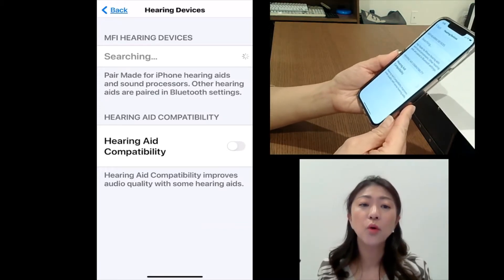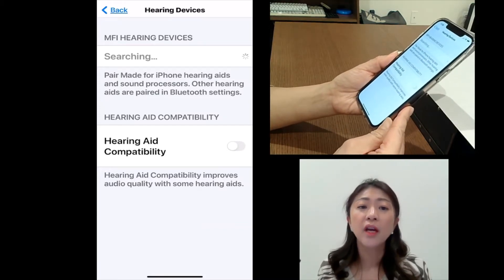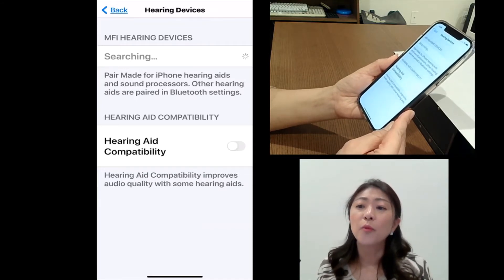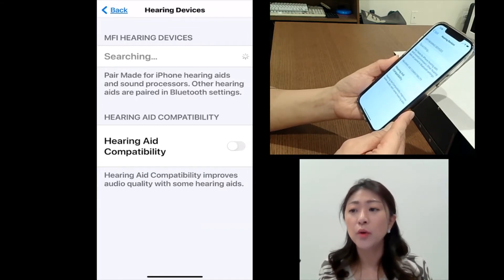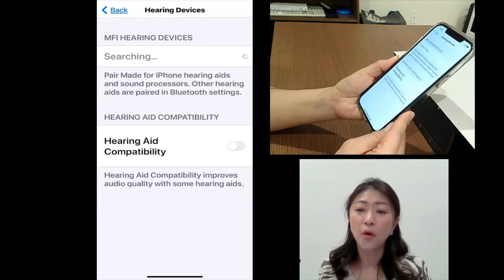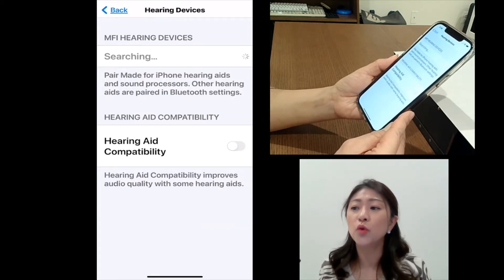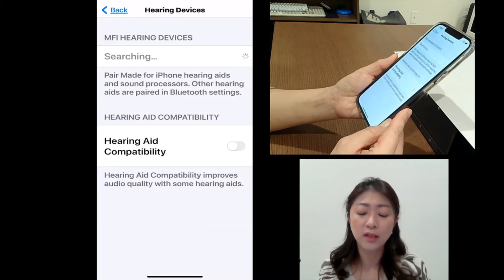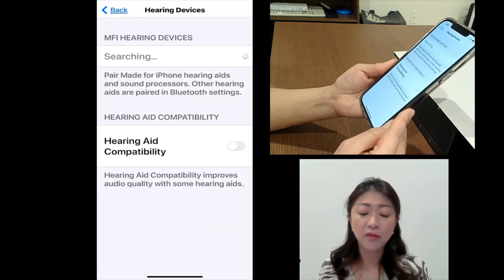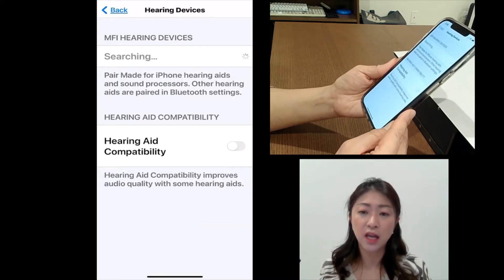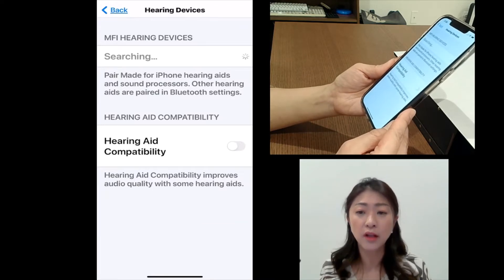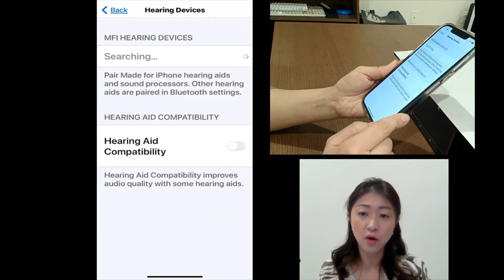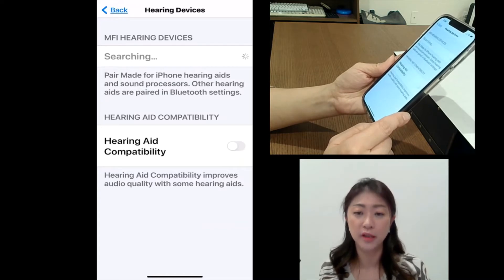Here, you also have a hearing aid compatibility option, which can improve the audio quality for hearing aids that use a telecoil for phone calls. If you have a hearing aid that has telecoil, then you can have this option on to have better audio quality.